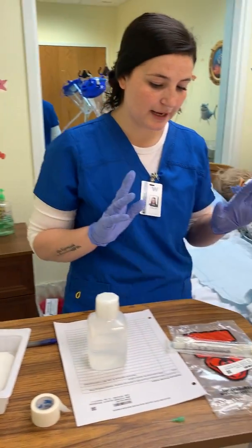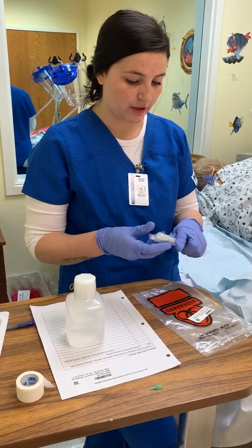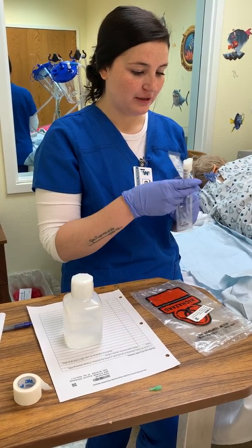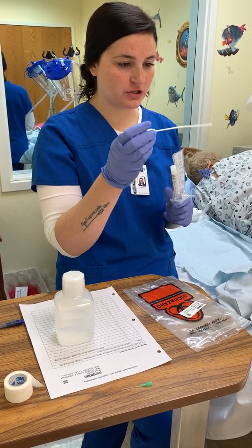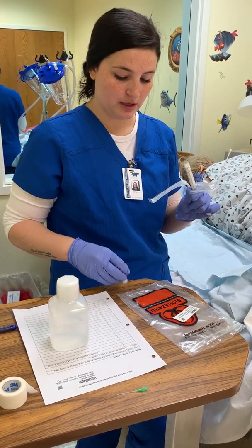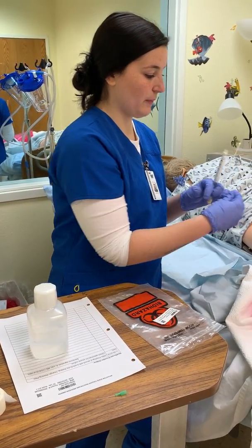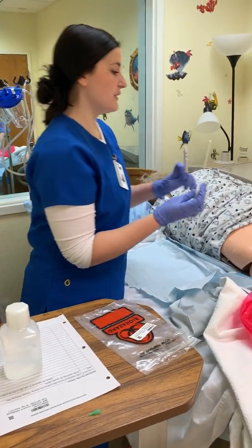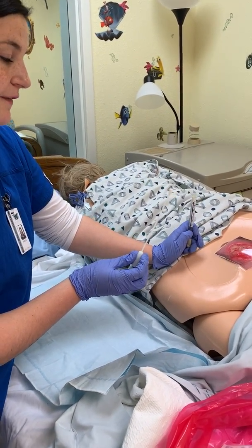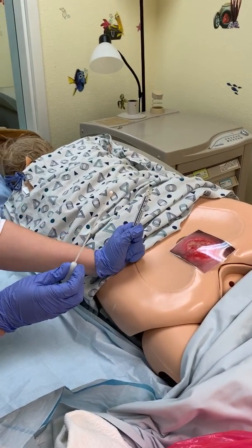Clean gloves, and then next I'm going to go ahead and get my specimen culture. So I have a clean, unopened culture here. I have my swab, making sure to take it out, not touch anything, and go ahead and uncap this as well. So when obtaining a culture, it's important I avoid any pus, any granulated tissue, slough, eschar, and just choose a portion of that wound bed that is nice and pink.